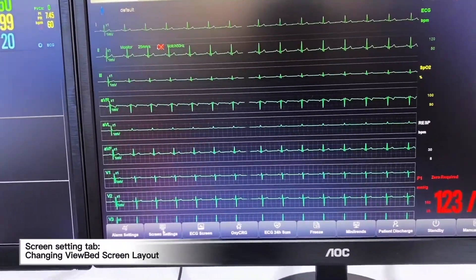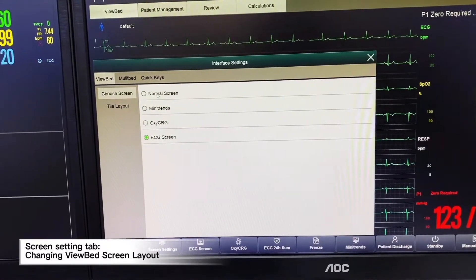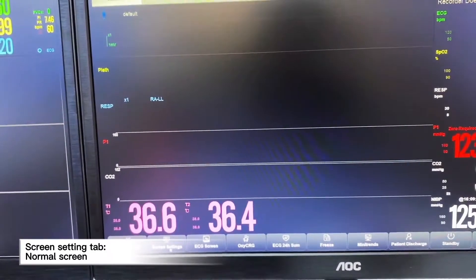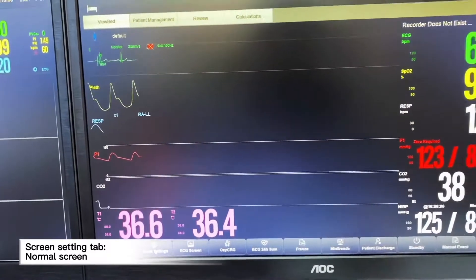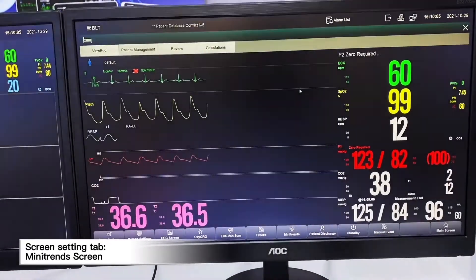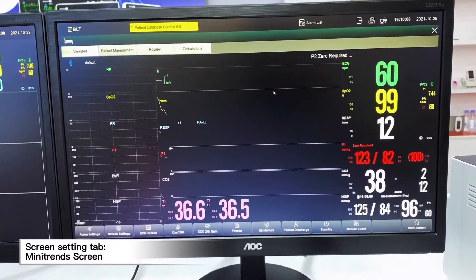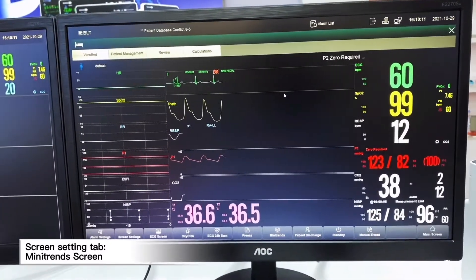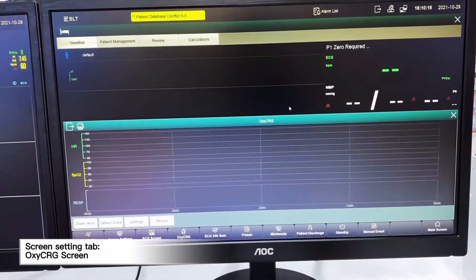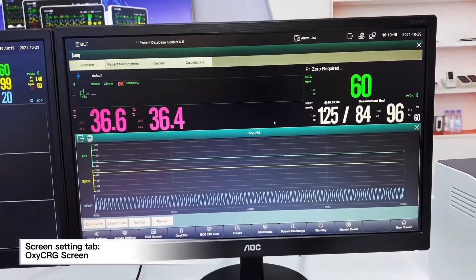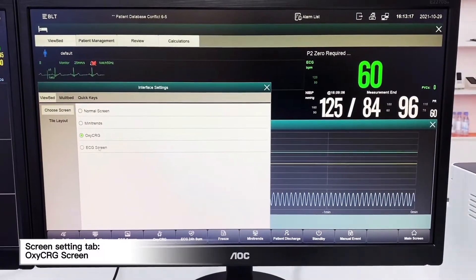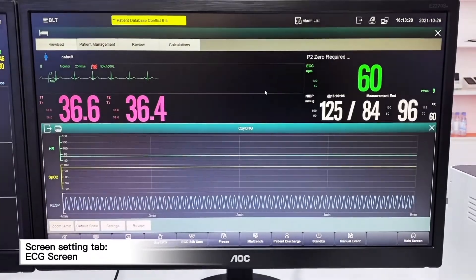We can also choose different screen displays. We can choose from normal screen, mini trend, and OxyCRG. When we choose ECG screen, we will be able to see all chest leads on the screen.